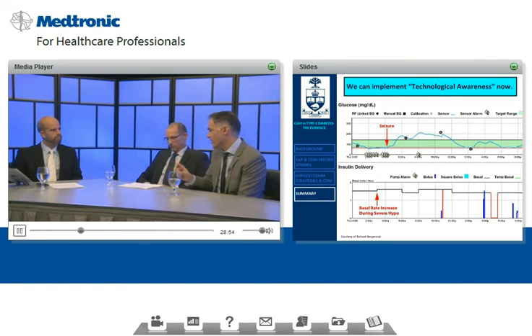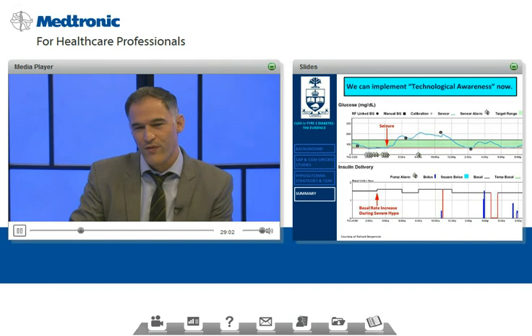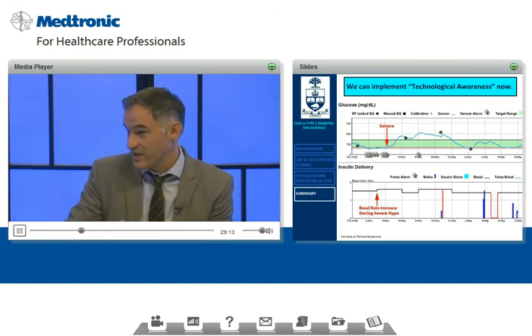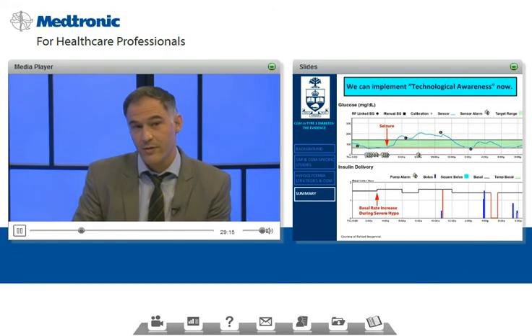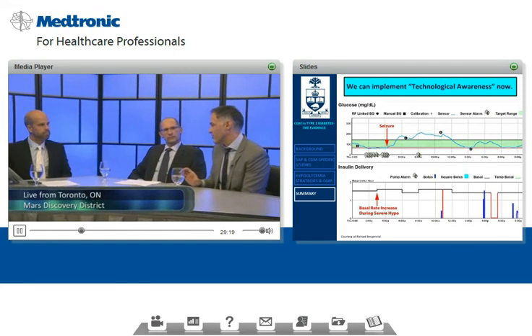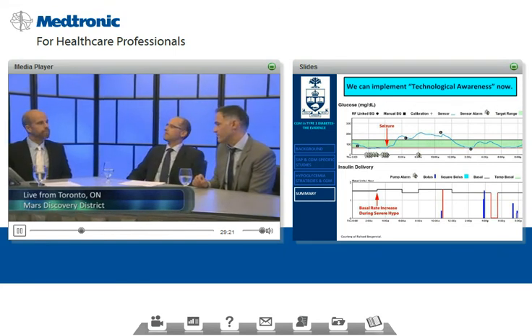So we have to refine that algorithm. I think this is an awesome first step. The second thing, of course, is here we're focusing on overnight hypoglycemia. We really need to have better algorithms that help to integrate decisions around bolus insulin and basal during the day to prevent hypoglycemia. But the real fear sits with overnight hypoglycemia, so it was a good starting point.